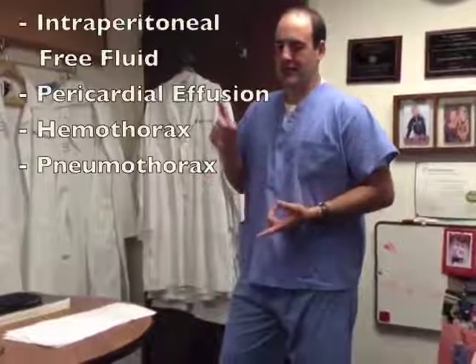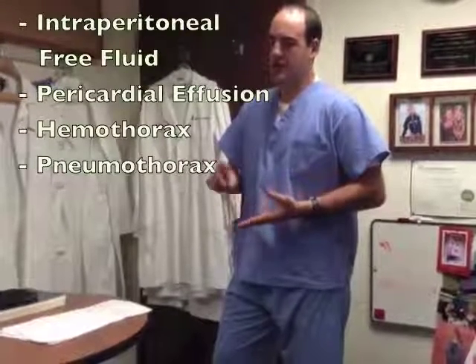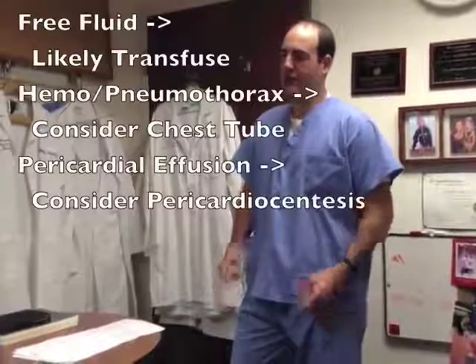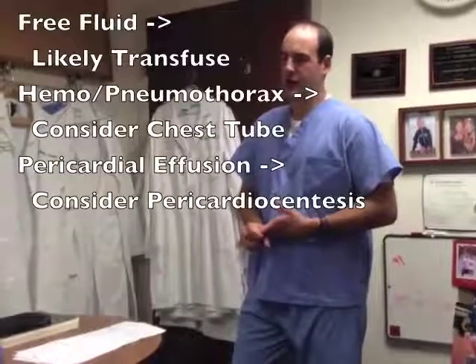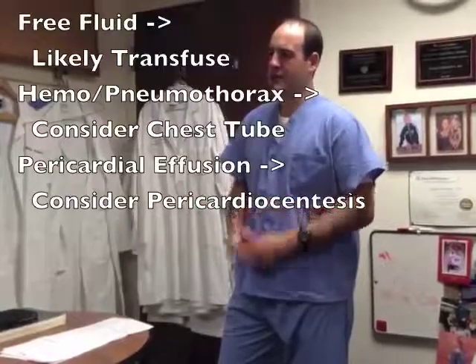Ultrasound is aimed at answering focused questions. What 4 questions does the eFAST answer? From what I remember reading, it answers questions like, is there intraperitoneal free fluid? Is there pericardial effusion? Is there hemothorax or possibly a pneumothorax? And what are the indications for it? Any blunt or penetrating trauma. And when's it most useful? I think it's most useful in hemodynamically unstable patients because it'll help guide your treatment, whether you need rapid fluid or blood resuscitation, or possibly a quick intervention like a chest tube or needle thoracostomy, or even possibly a pericardiocentesis.